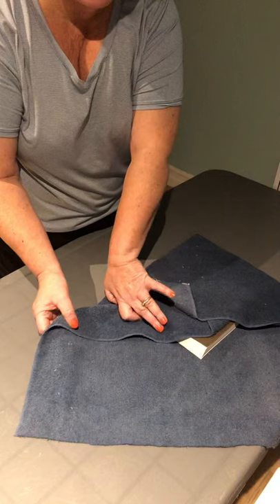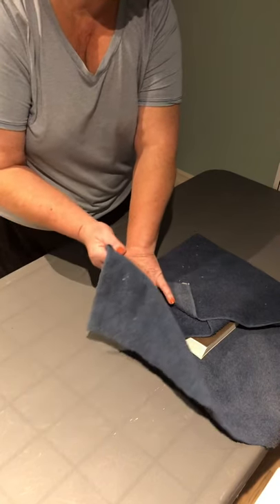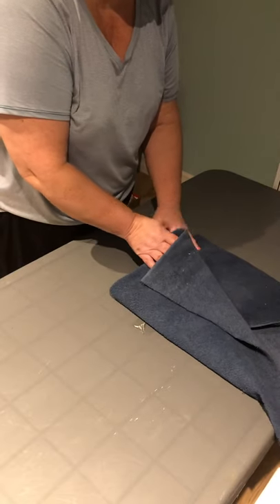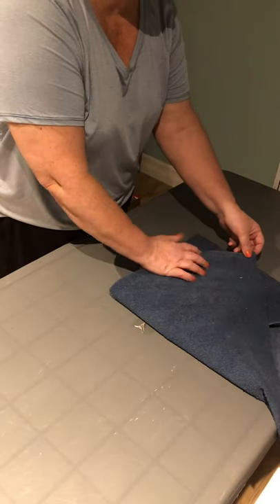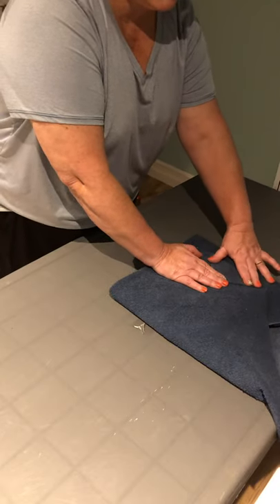I will repeat this on the right side. I will push down the material so it's not too bulky, fold over the right side, and fold back the tip to form a tab.